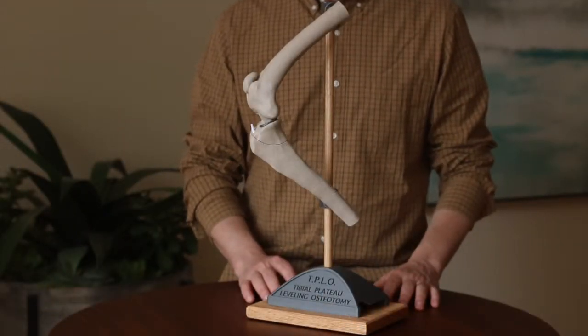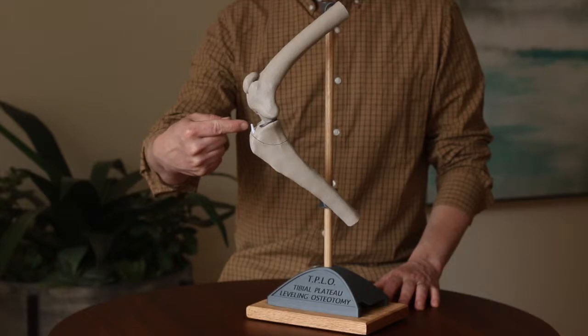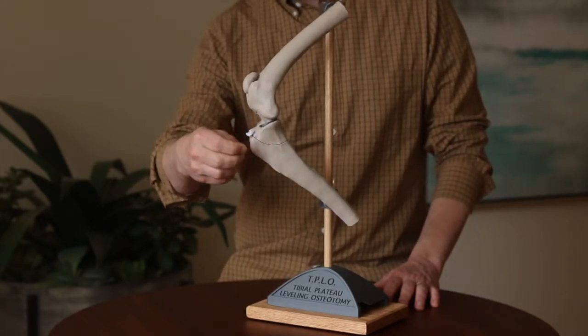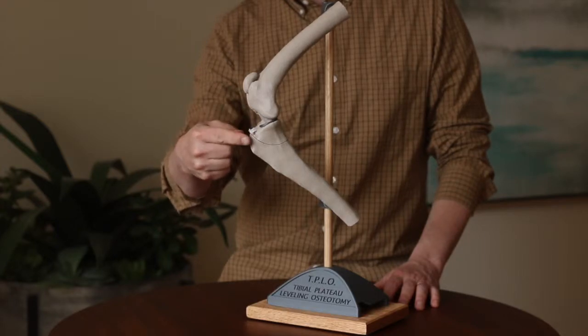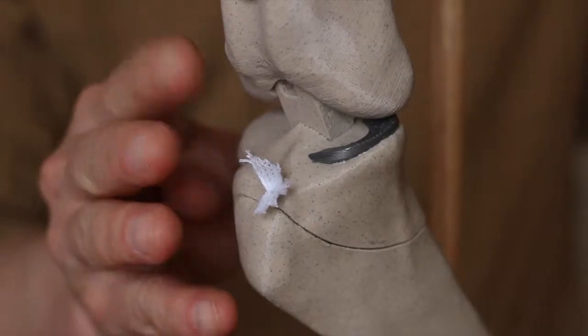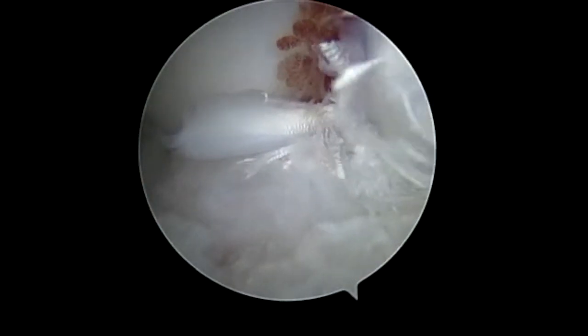The way we treat this injury in dogs is via surgery, and the first part of surgery is to look in the knee. That's the first time that we see definitively that there is a tear of the cranial cruciate ligament, and it actually looks remarkably like this with the fibers kind of floating out towards you. This is an image from inside a dog's knee, and you can see the torn fibers of the cranial cruciate ligament.